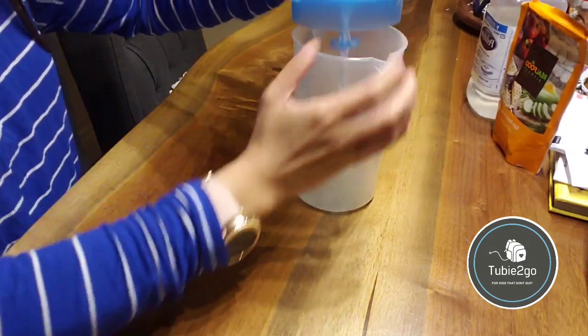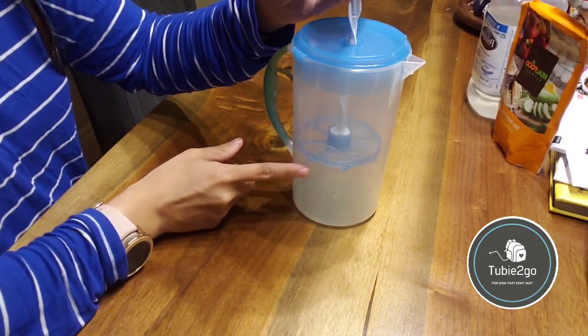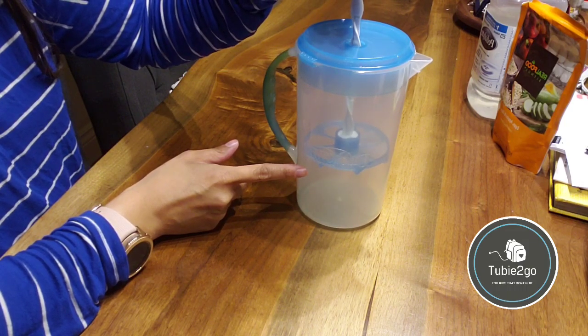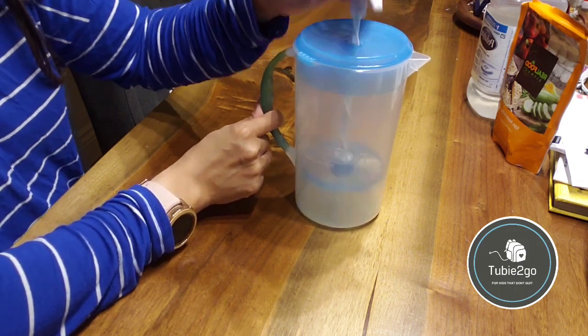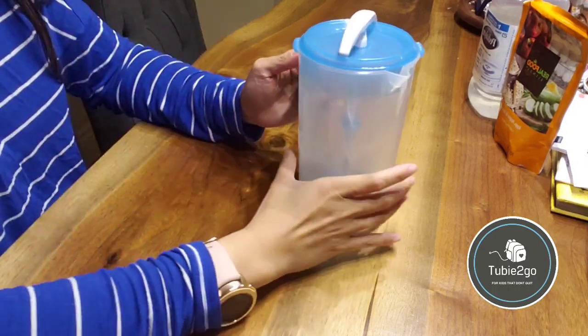The reason that's there is that it stops the mixer from going above a certain distance, so you're not pulling air into your mixture. For babies who are sensitive to gas, that's going to be very helpful.